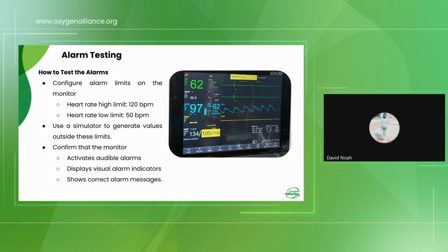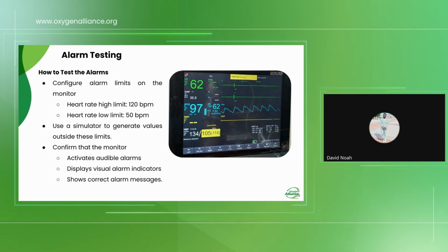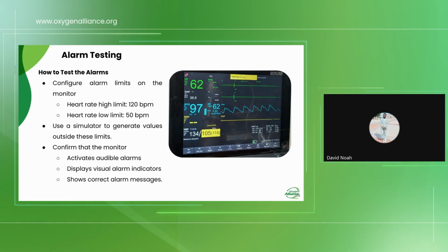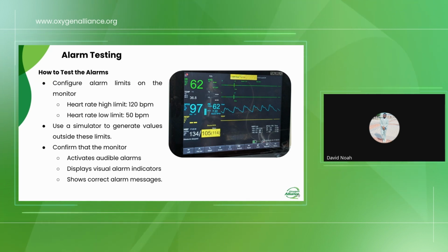Moving on, we have alarm testing as another important aspect of preventive maintenance. Alarms on patient monitors are lifesavers because they inform the clinicians when the physiological parameters fall outside the safe range. It is always important to make sure that these alarms are audible enough to be heard by the clinicians so that they can act accordingly on the physiological parameters that have discrepancies.